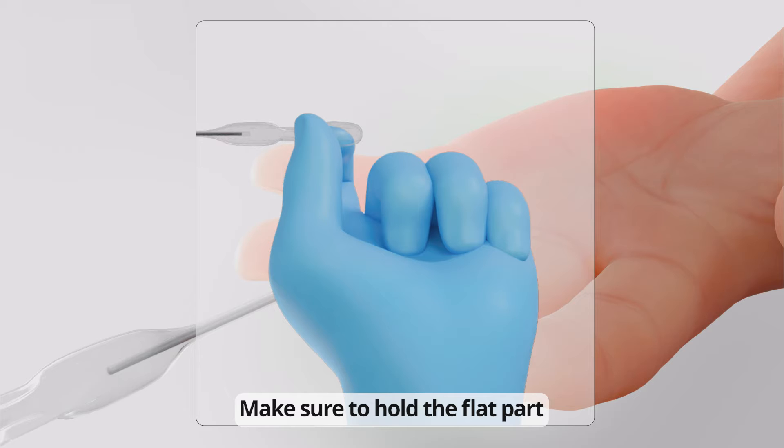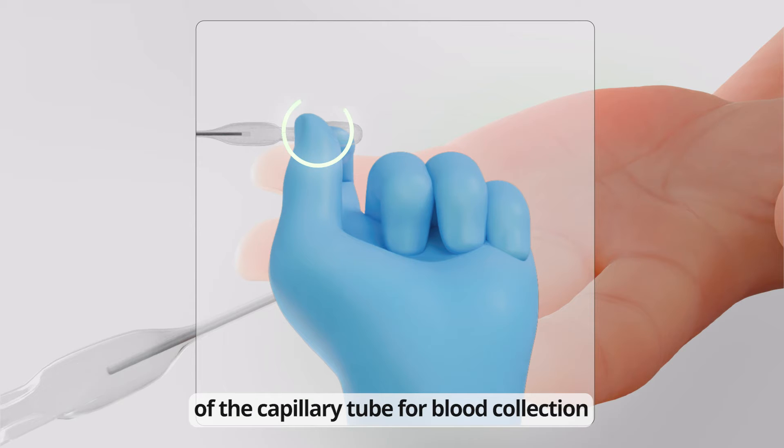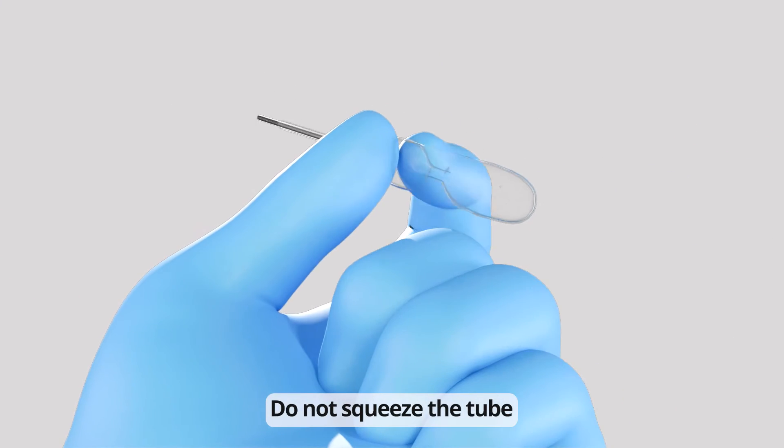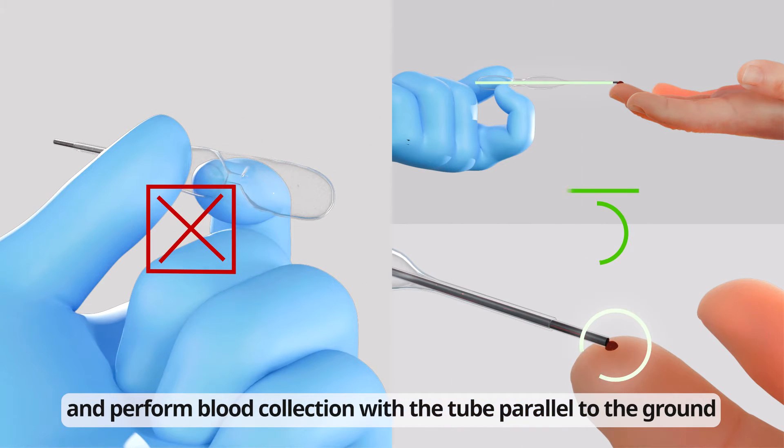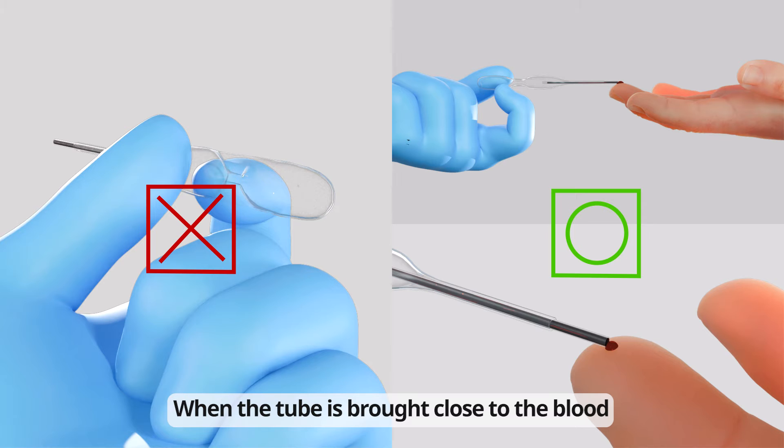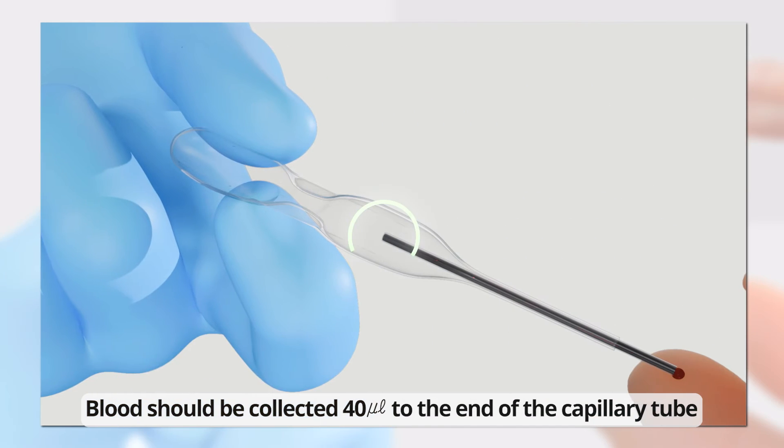Make sure to hold the flat part of the capillary tube for blood collection. Do not squeeze the tube and perform blood collection with the tube parallel to the ground. When the tube is brought close to the blood, the blood will be automatically drawn. Blood should be collected 40 microliters to the end of the capillary tube.